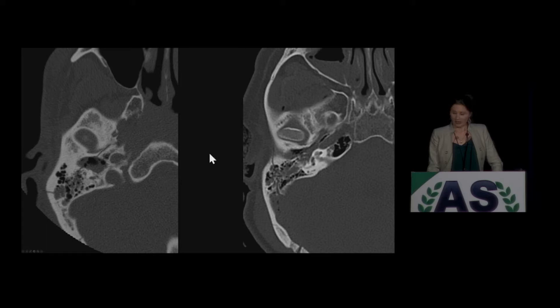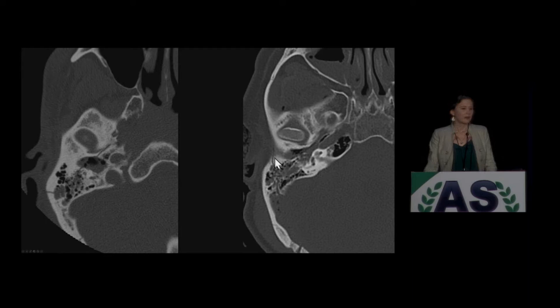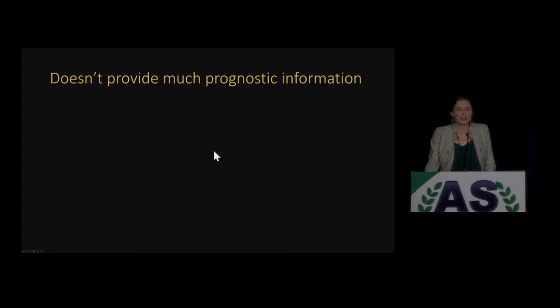Here on the left, you have a nice longitudinal temporal bone fracture, and then there's a transverse temporal bone fracture right here. This caught on pretty well because it's got pretty good inter-observer variability. But it doesn't provide a whole lot of prognostic information, unfortunately.